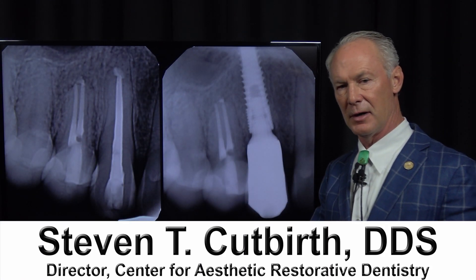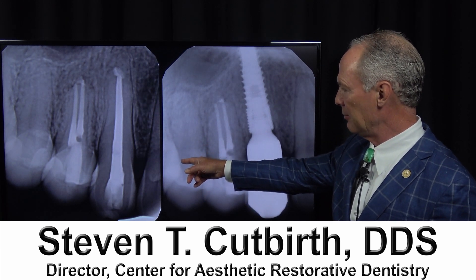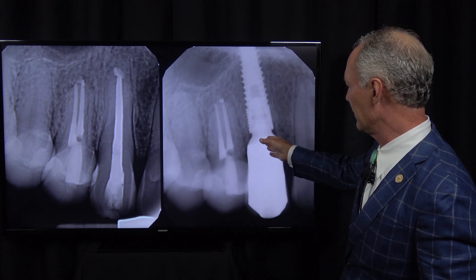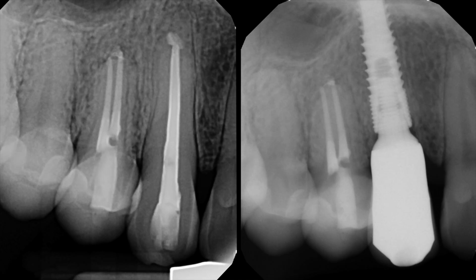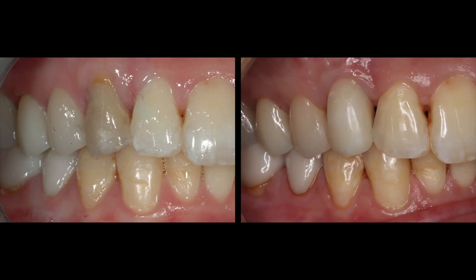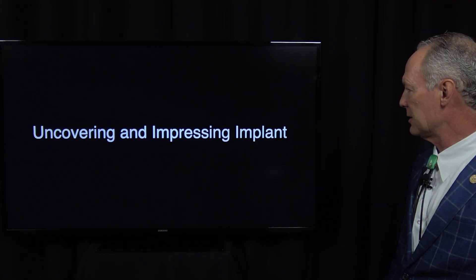Hello, this is the second part in this series on extraction of a maxillary right cuspid tooth and immediate placement of an implant, followed by a screw-retained implant abutment and crown. This shows the before and after the implant and crown, and the uncovering and impressing of the implant.